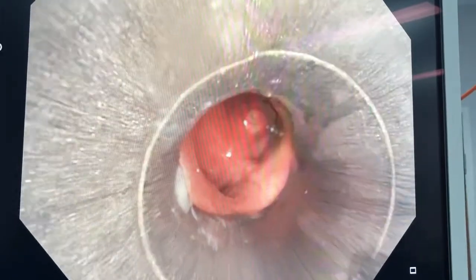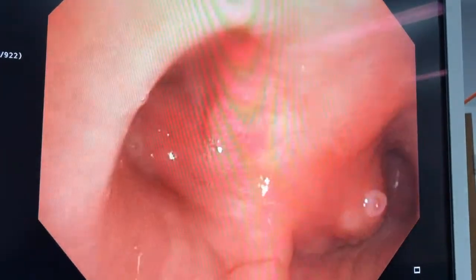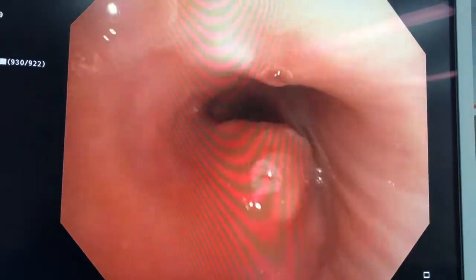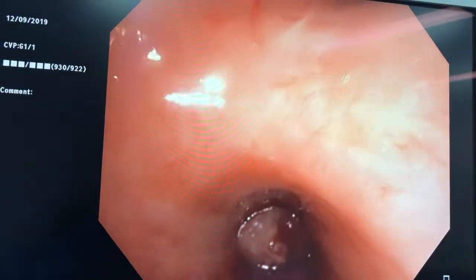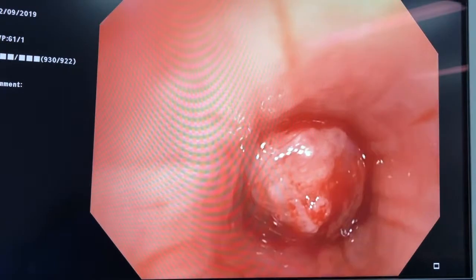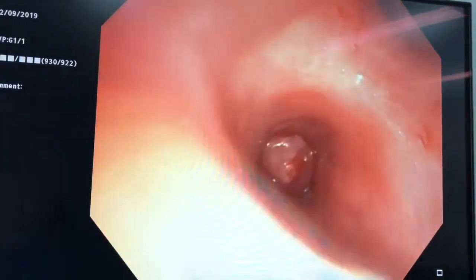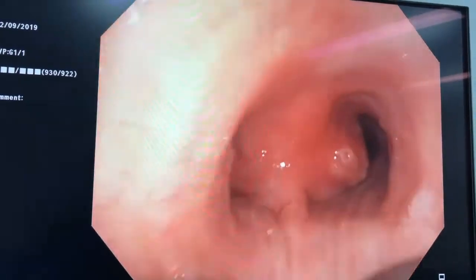Here's the flexible bronchoscope going through the rigid scope into the trachea. You can see the carina is splayed by a tumour in the subcarinal node, extending into the lumen of the left and right main bronchus. Going down the right main bronchus, the right upper lobe is clear. Here's bronchus intermedius, and there's the tumour almost completely obstructing bronchus intermedius. My bronchoscope won't be able to get past that tumour, so I can't see into the lower lobe. Let's come back into the trachea.